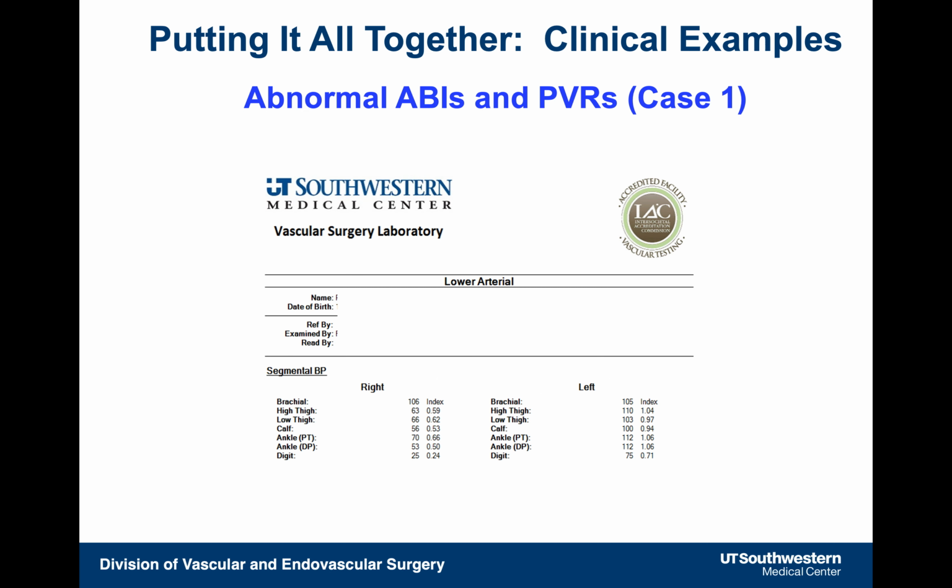Okay. Now we're going to go through some examples here, and I'll tell you how I would interpret the data as I go through this. So this is an abnormal test. The first thing I do is look at the ankle brachial index. So it's 0.66 on the right and a normal 1.06 on the left.